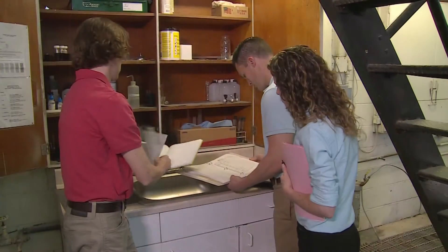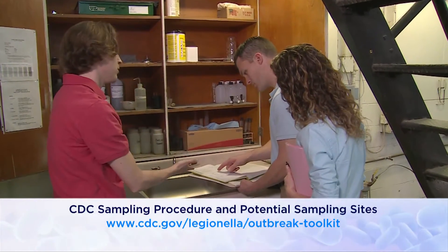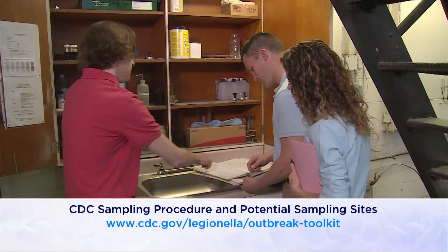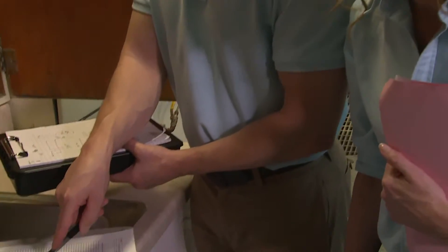Conduct an environmental assessment and make a sampling plan before collecting samples. This video should be used in conjunction with the written document CDC sampling procedure and potential sampling sites.